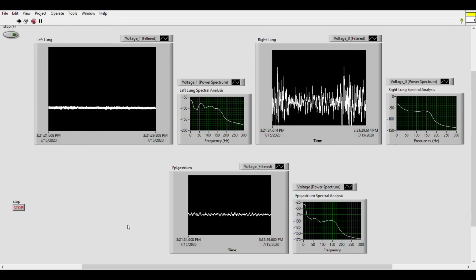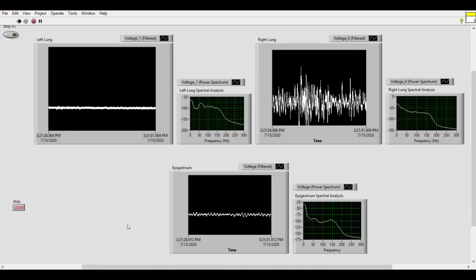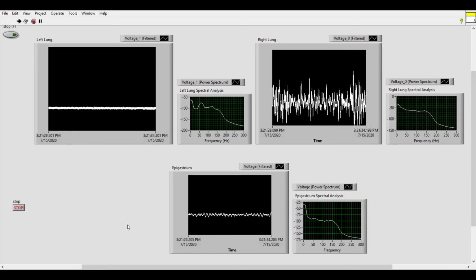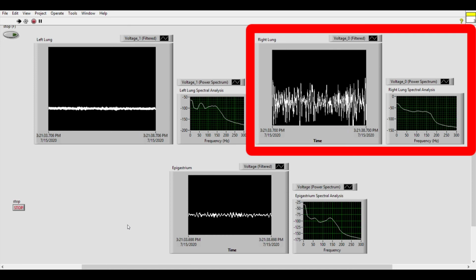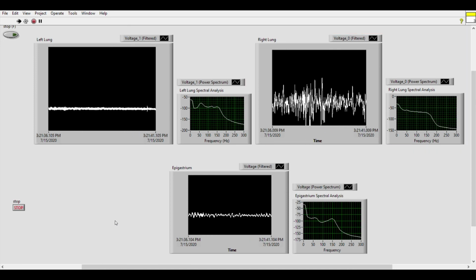Finally, if the ETT is inserted too far into the trachea, it can branch out and cause uneven inflation of either the left or right lung. Notice the amplified right lung signal. In a worst case scenario, this placement can result in the lungs collapsing.